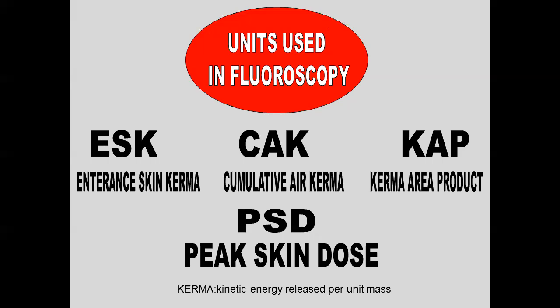Now, the VA and other institutions are now getting a little more, I'm going to say, strict. They're actually looking at fluoroscopy radiation safety a little bit more, and we have a new instruction at the VA that if we exceed 5 gray cumulative air kerma, we're supposed to put a note in the record, and we're supposed to do a 1-month follow-up to make sure we question the patient about skin burns, okay?